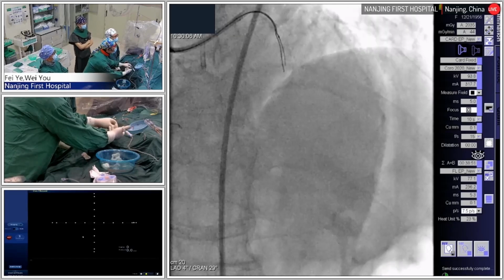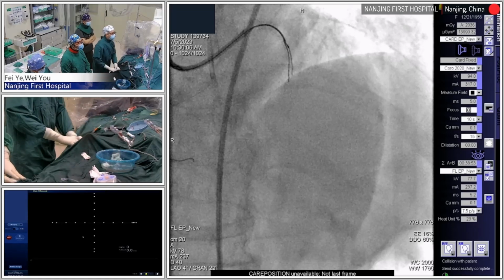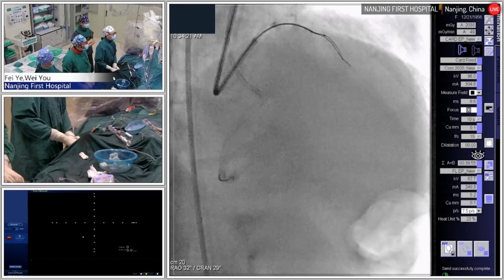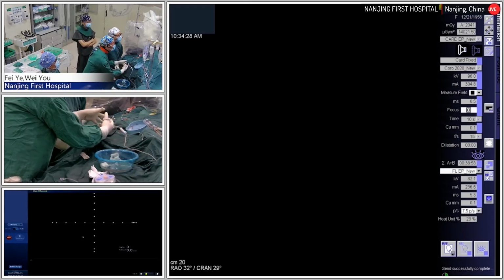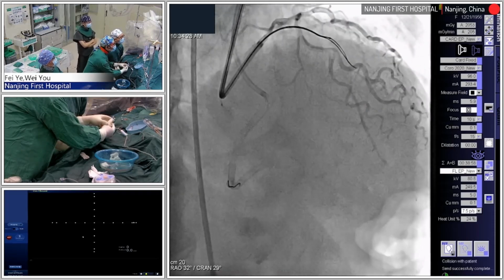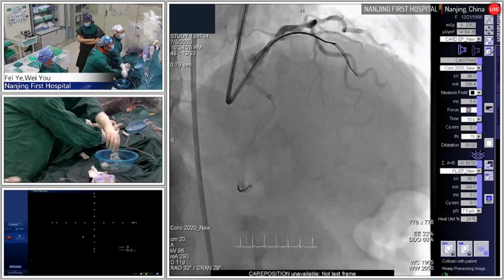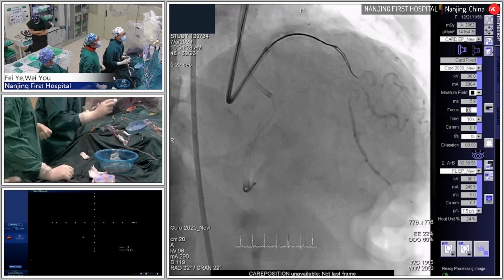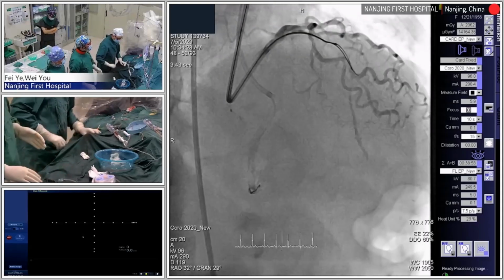This channel seems good. I need to change to RAO cranial. RAO cranial, please. Because we use angio-guided PCI, this is 2D, but the vessel was 3D. Okay. So Chief, I'd like to try to use the retrograde. Sure, maybe it cannot work now. Okay, no problem.